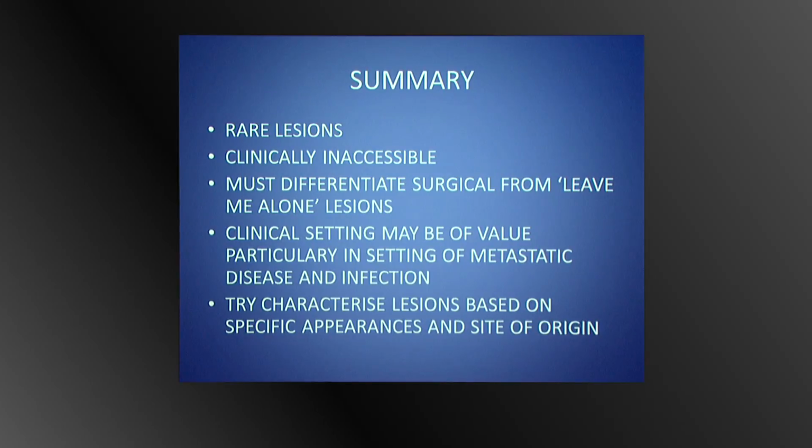But when we do, because the apex is clinically inaccessible and because it's such a difficult place to get to, we really need to get it right, and that is to decide, is it a real lesion, or is it a lesion that can be left alone, and that's the starting point. Thereafter, your clinical setting may add value in the setting of metastatic disease and infection, and if it's not one of those, I think we should just try to characterize it based on its appearance and its site of origin.